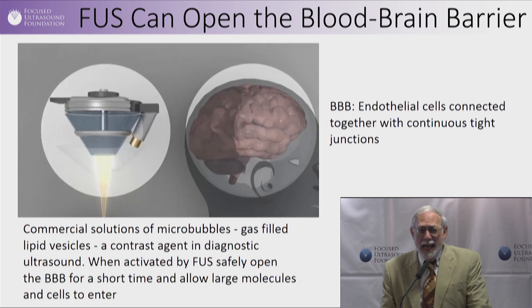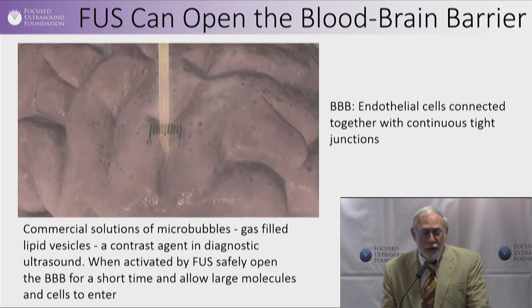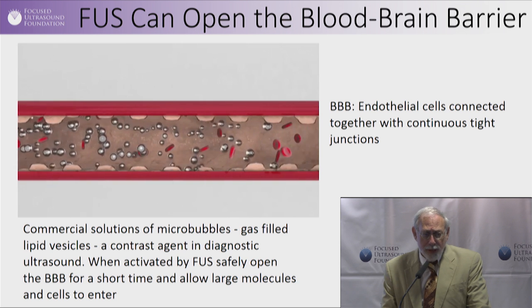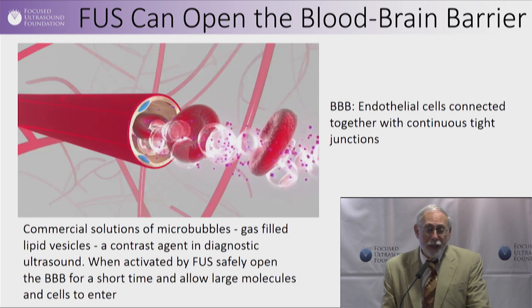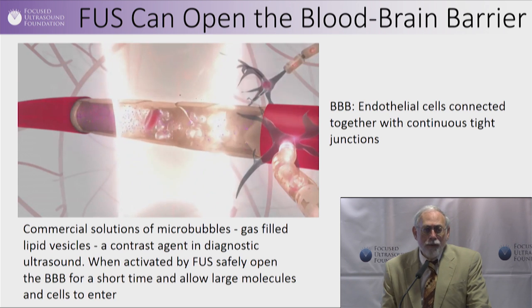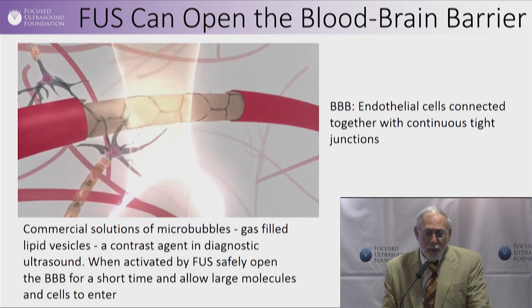And for the last 40 years, there have been very primitive techniques to try to open it, but it can be opened with actually relatively low amounts of power, as you see in this animation from the Columbia group, to essentially put microbubbles that are commonly used as contrast agents if you've ever had an echocardiogram. If you get an injection, that's what you're being injected with so that you get better pictures. But when more intense ultrasound hits these microbubbles, they vibrate very violently, and some of them even explode. And that force pops open the specialized lining, all of the lining cells normally in the brain, they're all linked together. And when that area of targeted focused ultrasound hits that area, they really pop open.